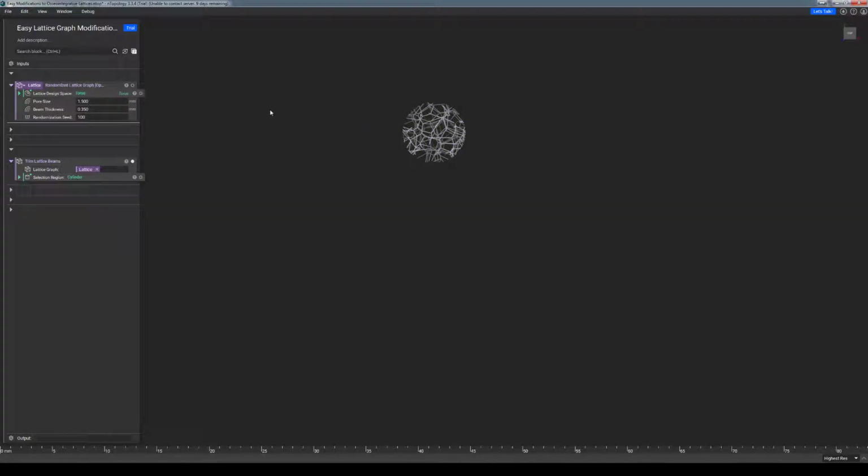What also should be noted is that this selection region works more like an intersected region, not a subtracted region. This means that for the implicit body used, in the case this cylinder here, the lattice inside the implicit body is what will be retained, and what is outside is going to be what is removed.